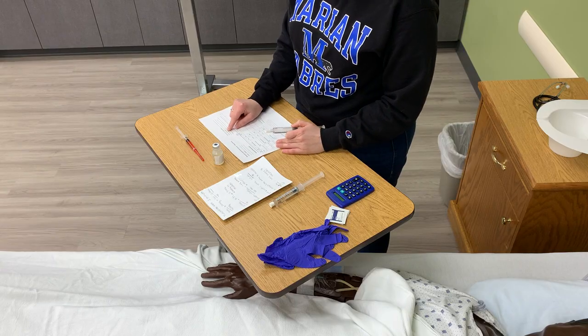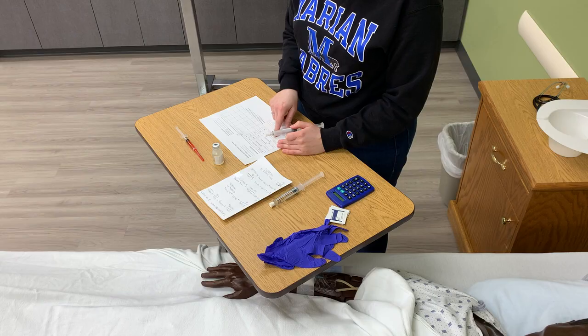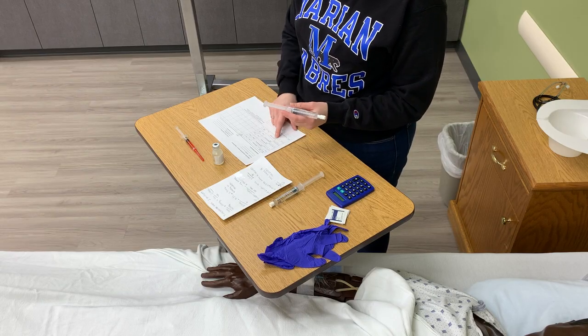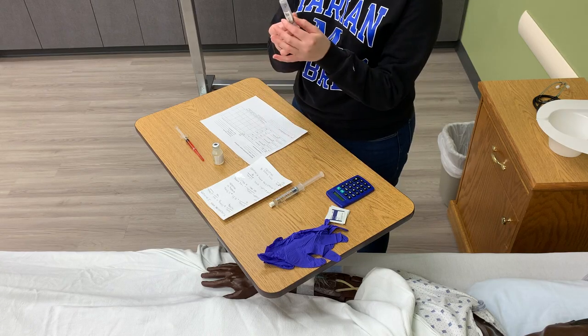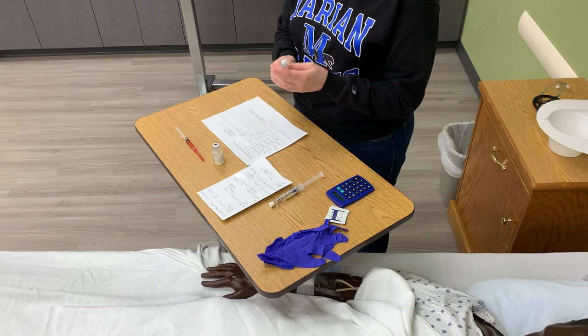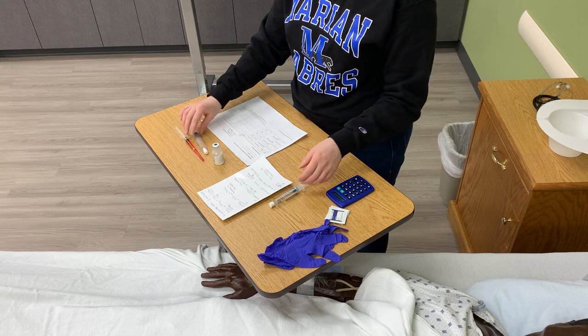So I have Casey Banks, 10/2/1965, allergy to aspirin, order for 0.9% sodium chloride, IV flush, this is for IV flush, BID, 10 mLs, this has 10 mLs in it at 0900. It has not been given today for that due time. It is not expired, does not contain aspirin, and the package integrity will say is intact.